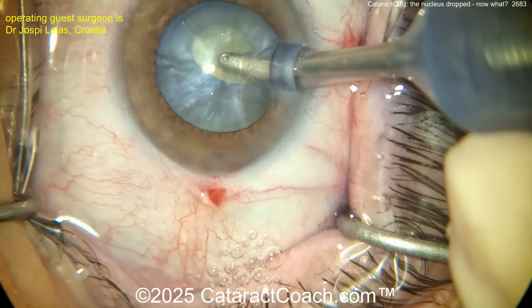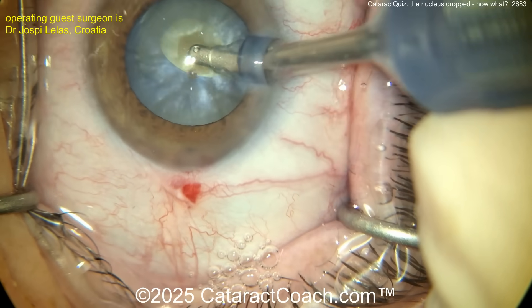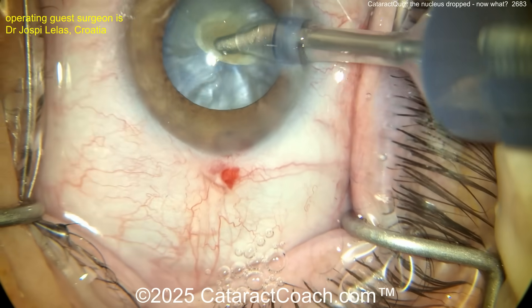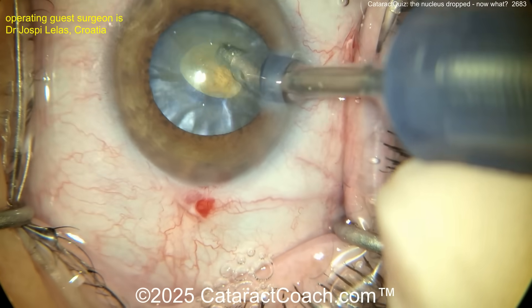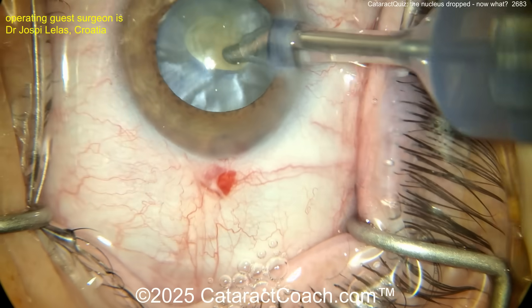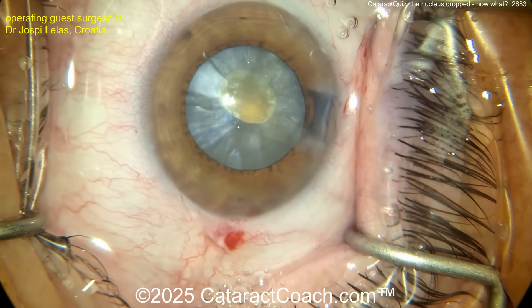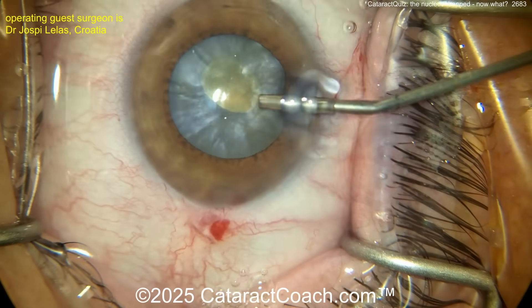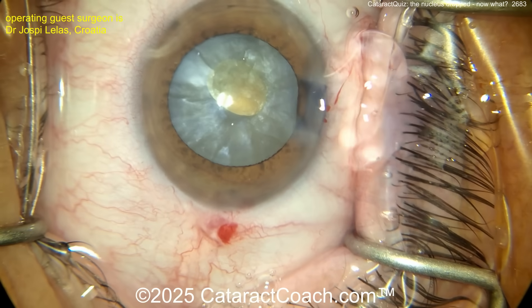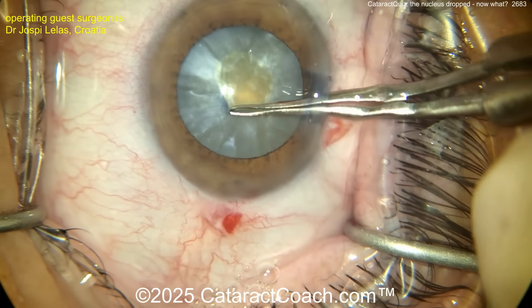Going into the eye with the probe, just aspirating to try to debulk this and rock the nucleus back and forth to get out any liquefied lens material that's behind the nucleus between the nucleus and the posterior capsule. But the question is: why did the patient get a white cataract? The history here is important. What if the patient got a white cataract a month after an intravitreal injection? Well, now what are you thinking? I think you hit the lens capsule.